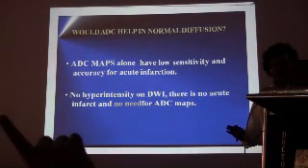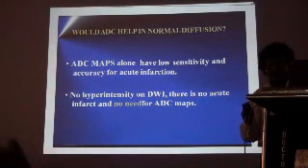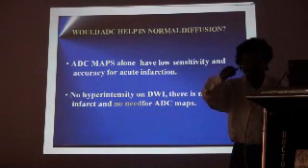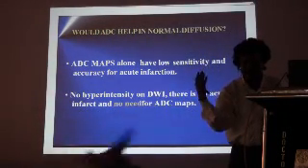Sir, one question. In case of early stroke, as you have shown in earlier pictures, the first scan is DWI negative, and the repeat scan shows DWI positive. In that case, is ADC required? Initially it was negative. After 12 hours it was positive. Yeah, so in that case, the ADC map can help.